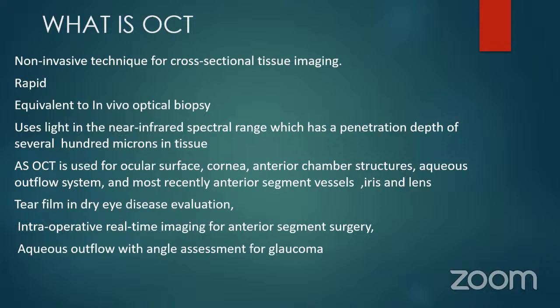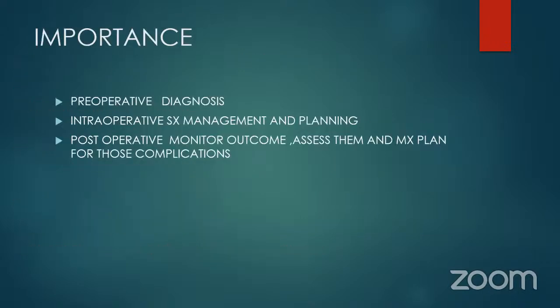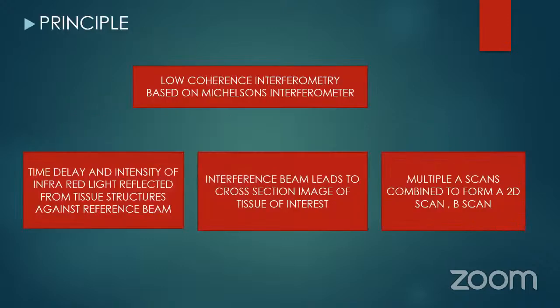It can be used to assess the tear film in dry eye disease. Also, it can be used intraoperatively for real-time imaging during anterior segment surgery. It can be used to assess the aqueous outflow with angle assessment in cases of glaucoma. So the importance is pre-operative diagnosis, intraoperative surgical management and planning, post-operative monitoring and assessing the outcome, and management of any complications.